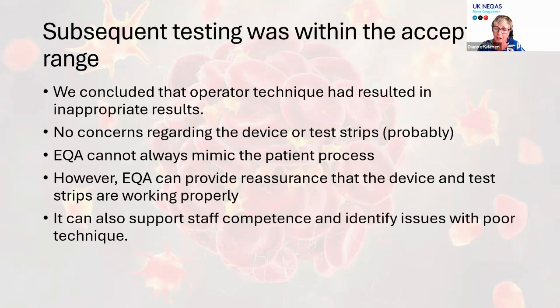And we can say that the EQA can't mimic the patient process, but it can provide reassurance that the device and test strips are working properly, but only if you follow the instructions and the operators have competence in this. And it can also flag up competence issues and people who are just bending the rules and not following the instructions. It will show up in the testing.